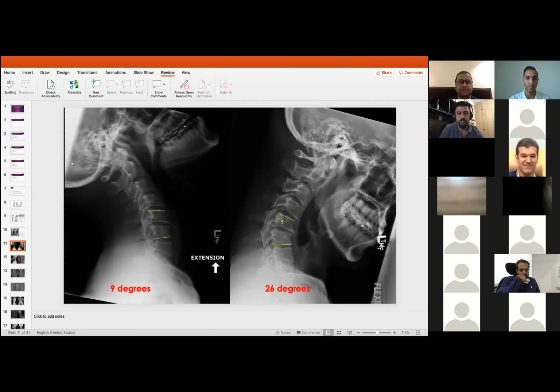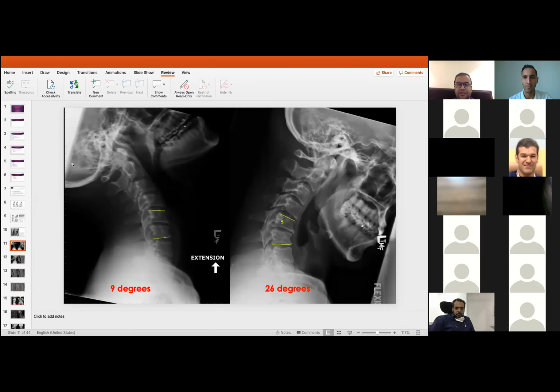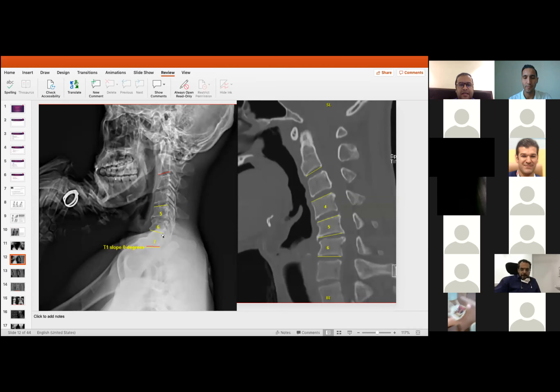If you look at this patient, he's 47 years old, a professor at the university, left-handed, with radiculopathy at 2 levels. Looking at the extension and flexion images, it seems reasonable, but he has some focal kyphosis at C5 and C7. But a very significant thing that I learned in this case from Dr. Courier, my mentor at Mayo Clinic: it seems like neutral alignment here, but if you measure the T1 slope, it tells you that you don't have to go crazy and correct the lordosis in this patient. This patient has a neutral alignment. You cannot correct him into lordosis because he's going to compensate above that.